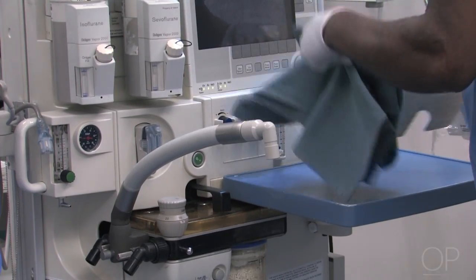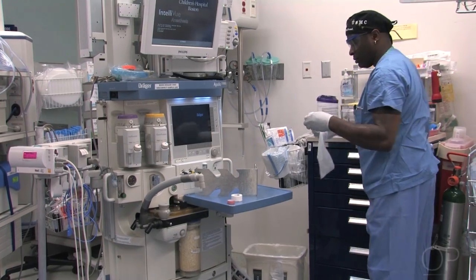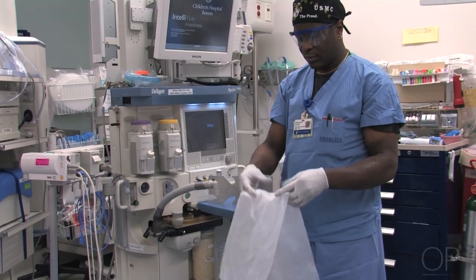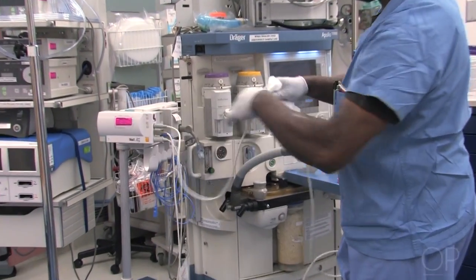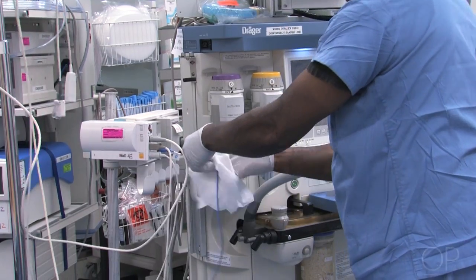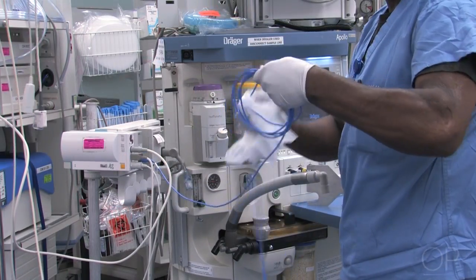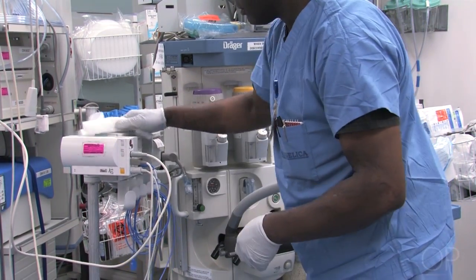The blue towels go into the laundry bin. Then we get some germicidal wipes to start wiping down anything that is reusable. All cables and wires are wiped down one at a time, not as a group, and then hung so that they may dry.